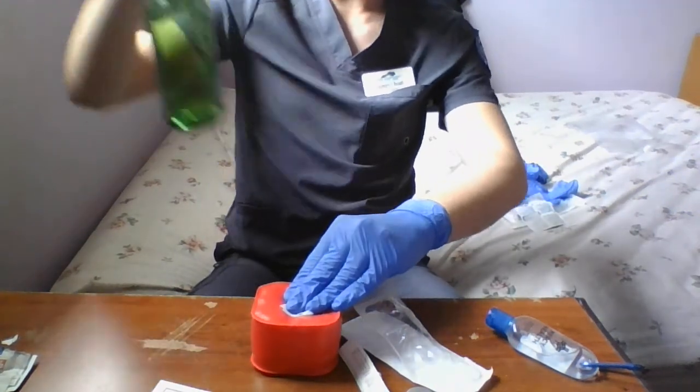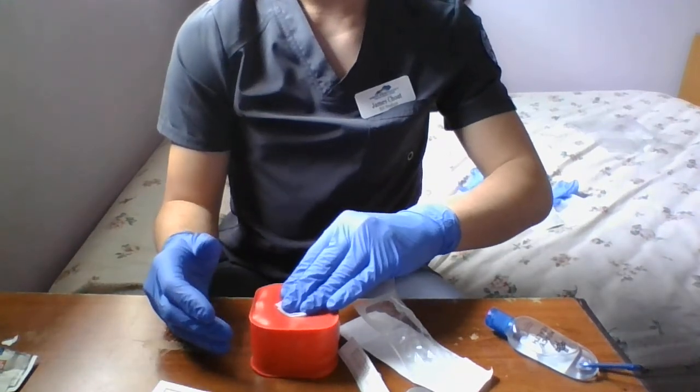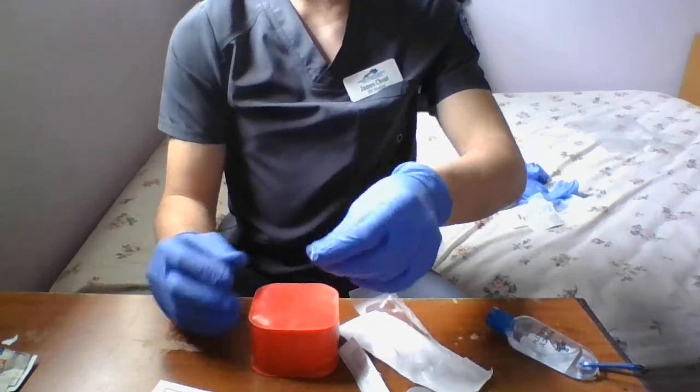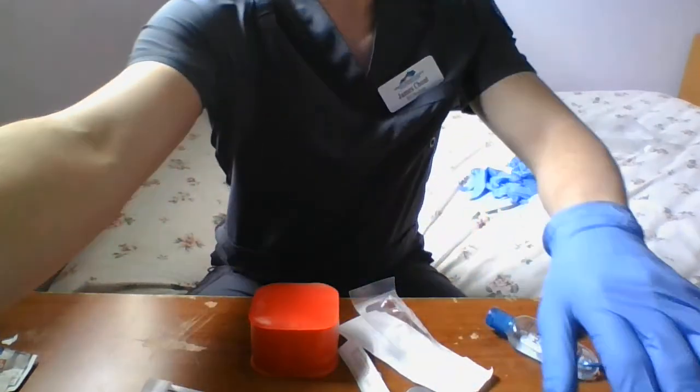Trying to. It's in a glass bottle. Apply pressure for 5 to 10 seconds. You don't want to massage it, just light pressure. I can take that away. I'd put a bandage on it if I needed to. No redness or anything.